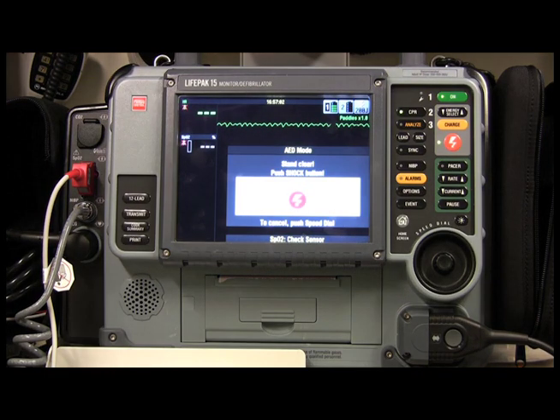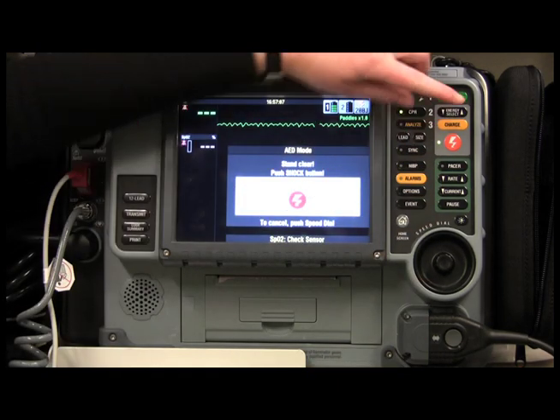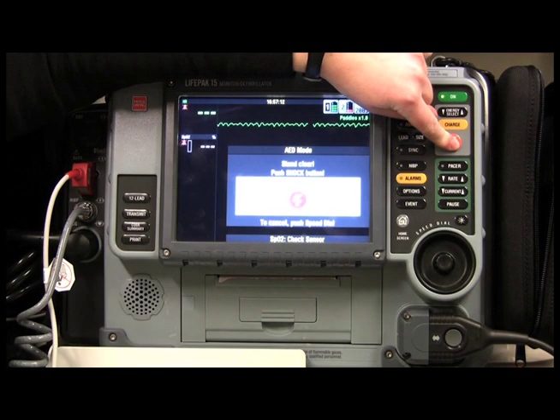So you're looking around, stand clear, push shock button — no one is near. Our shock button is right here. Once again, check that no one is touching the patient and you can go ahead and shock.